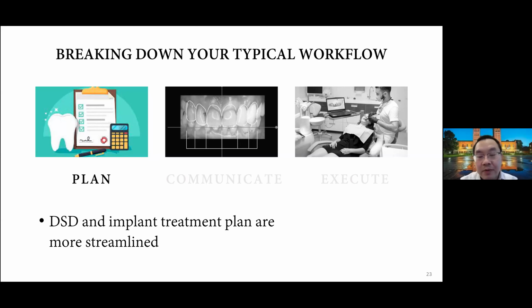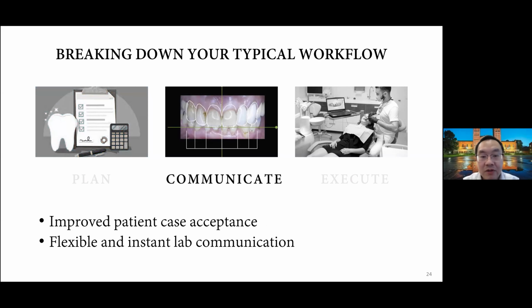But if you have a photo, a patient's face photo, a patient scan that's very personalized for them, it's much easier to accept and visualize, especially for large, expensive aesthetic cases, right?